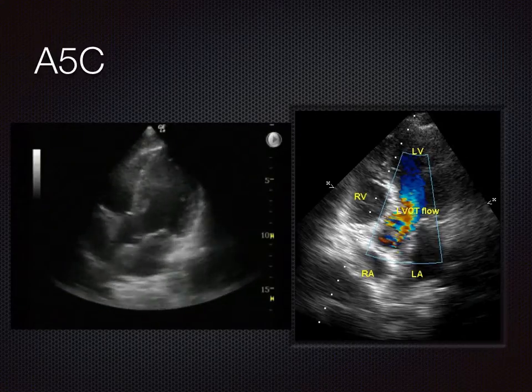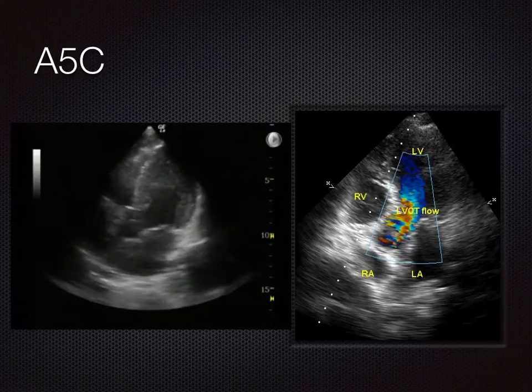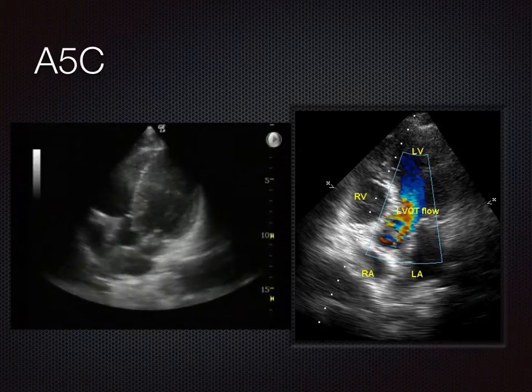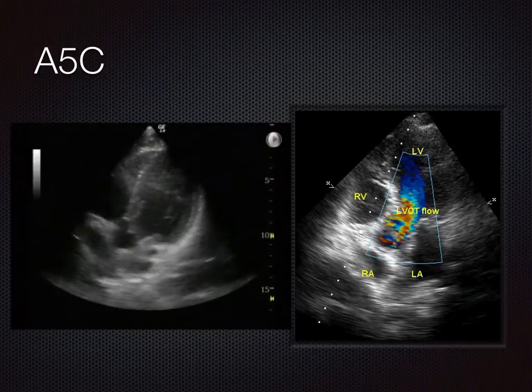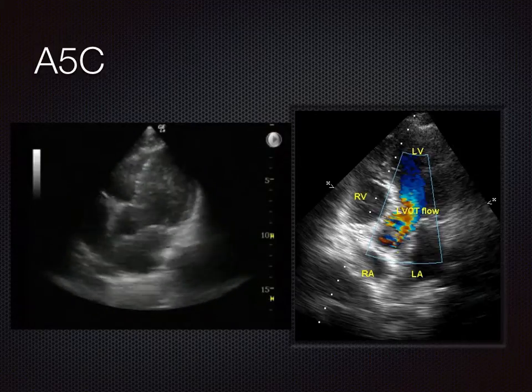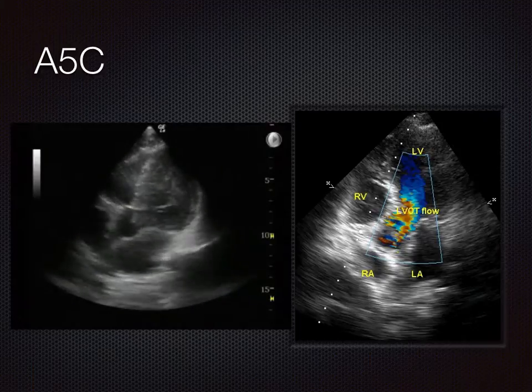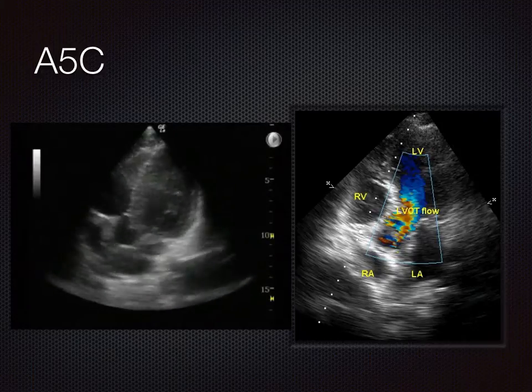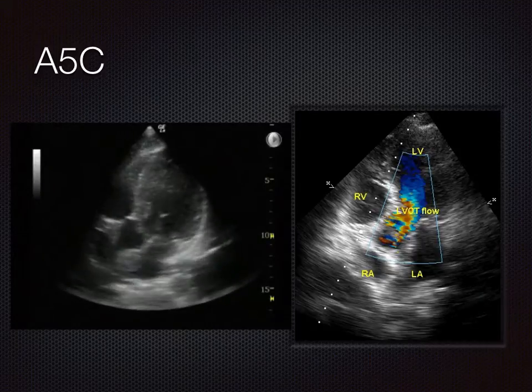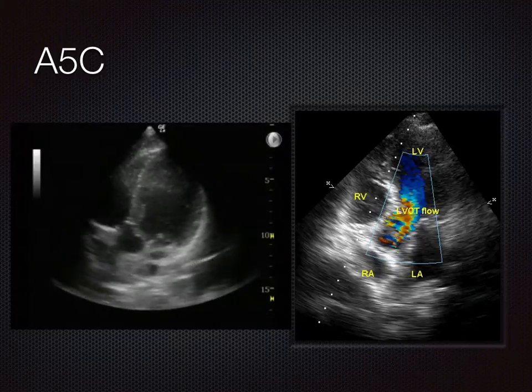So this is blue away, so it's probably in systole, so it's being squeezed out the blood through here, and as it goes through, it's slightly narrowed and it's becoming turbulent. But you have to be cautious of always saying this is turbulent or narrowed flow, because it all depends on what settings you've got your colour to respond to. So you can set that for different velocities.